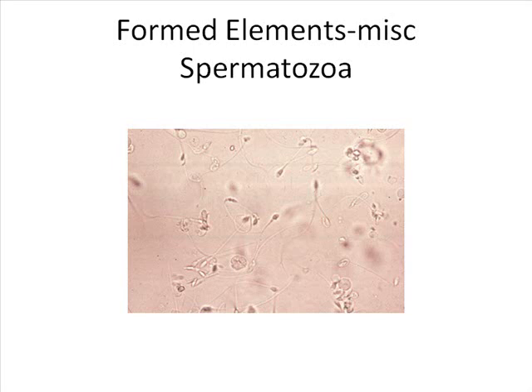All right. But they can be significant, and maybe an older male who has prostatitis or something of that sort going on. Sometimes when people have cardiac failure or they have an MI and they're brought back, remember most things basically open up, so you will see then spermatozoa in the urine at that point in time. So depending on what's going on with the patient.